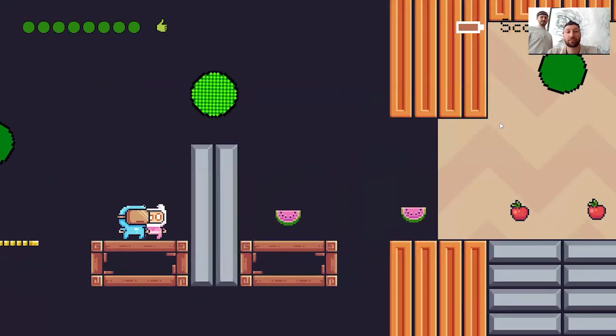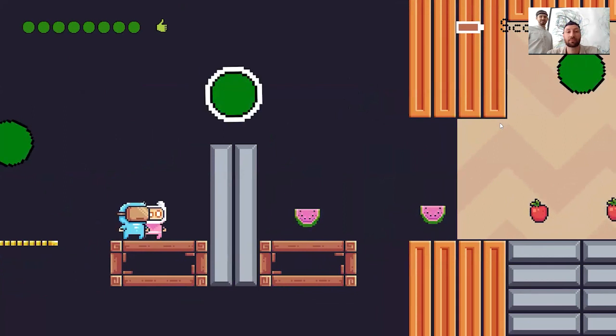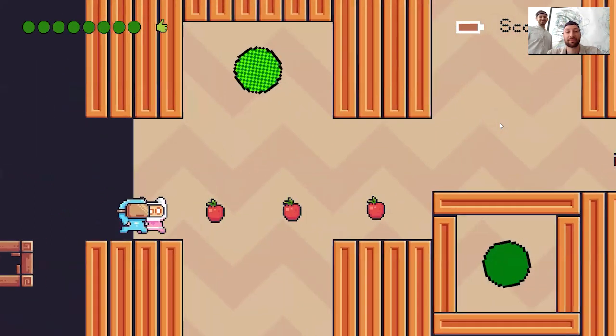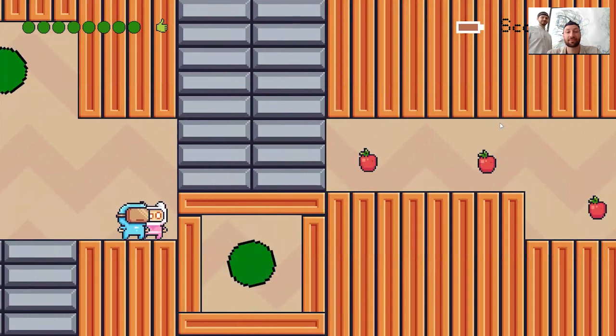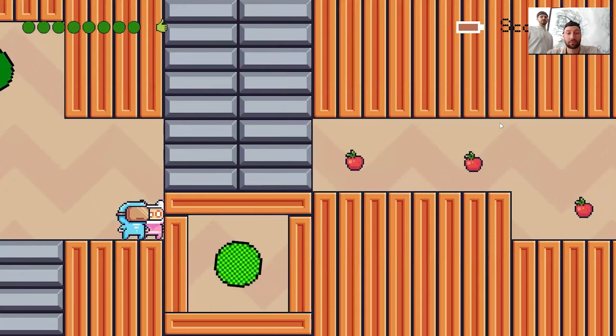So Leo has almost completed the game. Just one more selection. Yes. Go, go, go. Yes. Last selection. So typically with some good EEG signals, and if you can focus well, you can select items within 2 to 4 seconds.